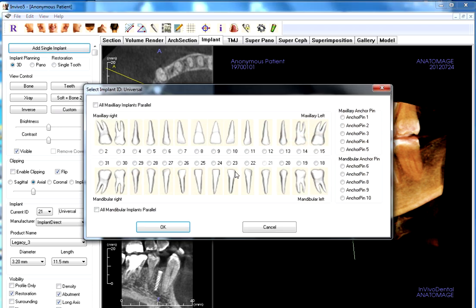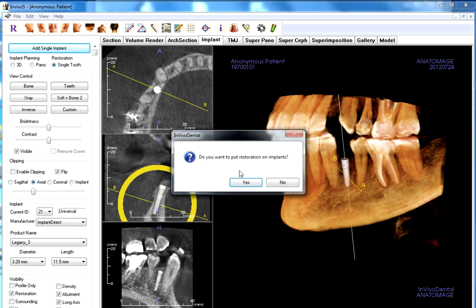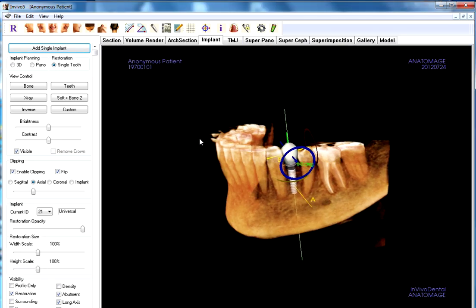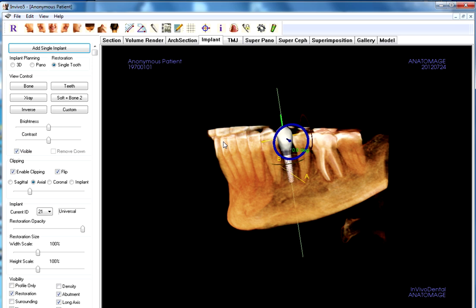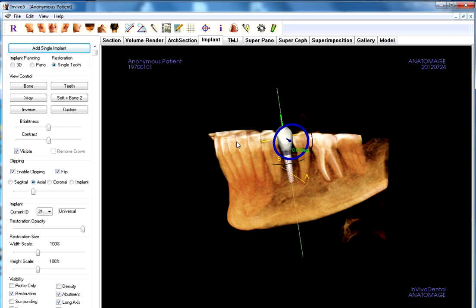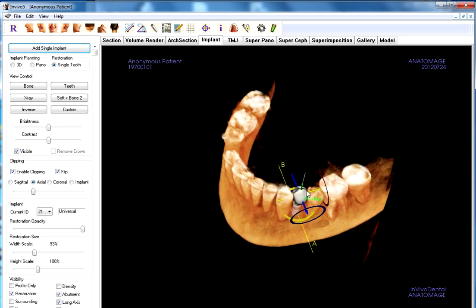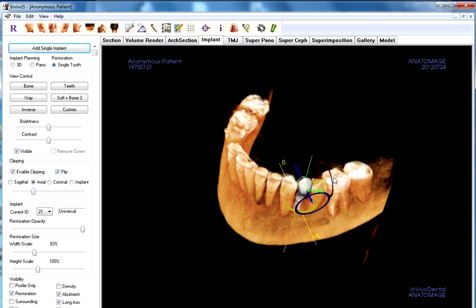Let's go ahead and add a restoration with an abutment on there. With this I can use the clipping feature so I can remove the top teeth and just look down on the occlusal. I can tell it needs to be a little bit skinnier. I need to move it more buccally, and I also need to tilt it — tilt the cusp tip out buccally just a little.